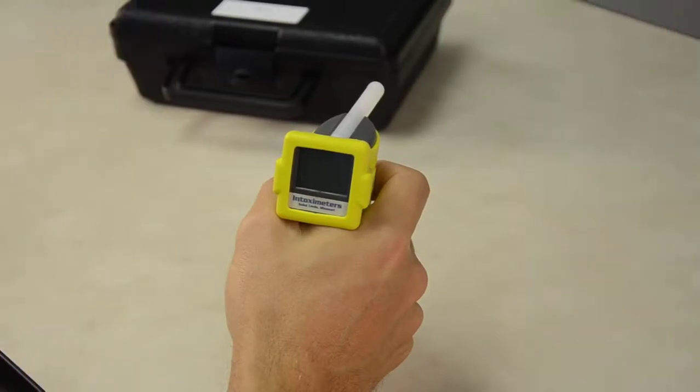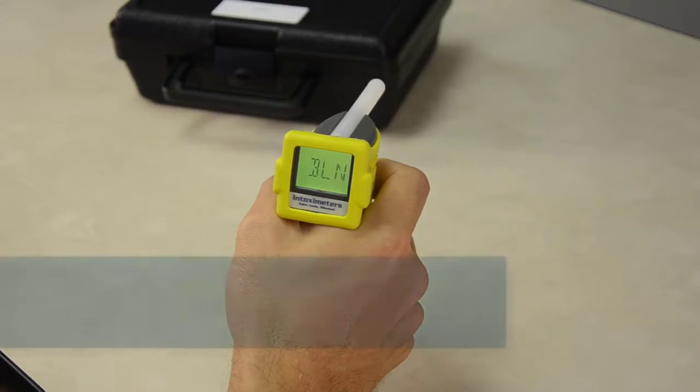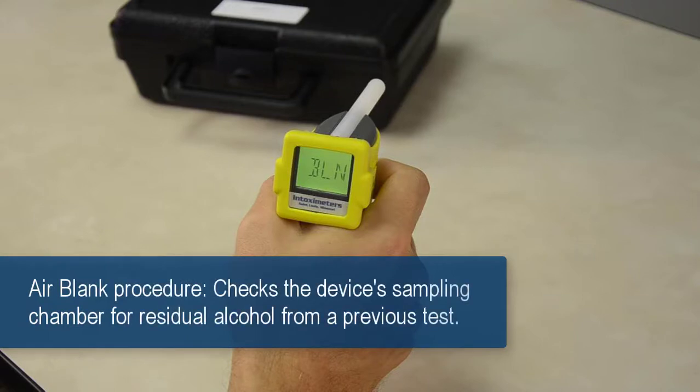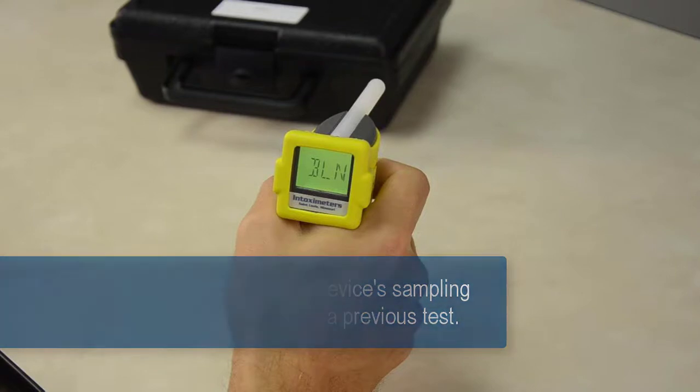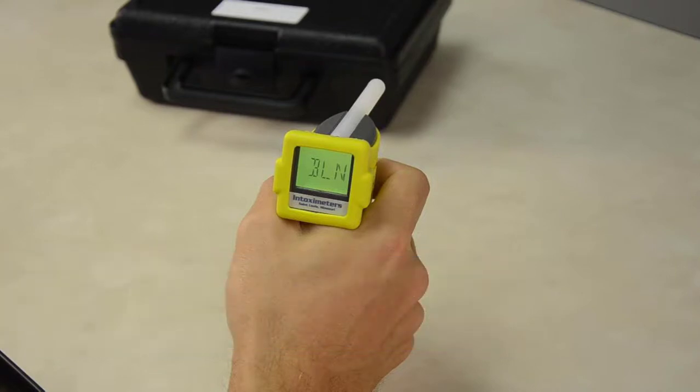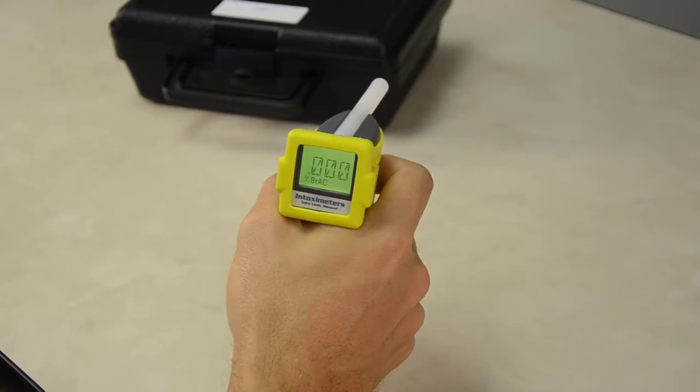Some versions of the AlkaSensor FST will display BLN, which means the instrument is performing an automatic airblank procedure. An airblank is a procedure that checks the device's sampling chamber for any residual alcohol that may remain from a previous test. If the airblank shows no residual alcohol, the operator will see .000 in the display and the instrument is ready to perform the next test.